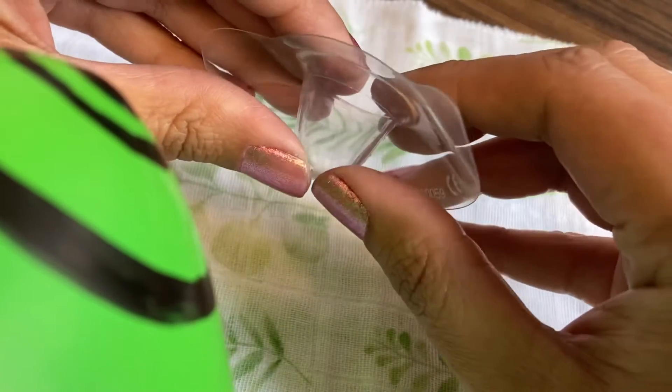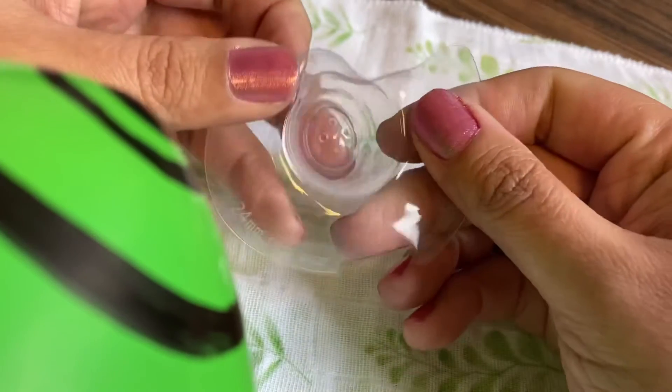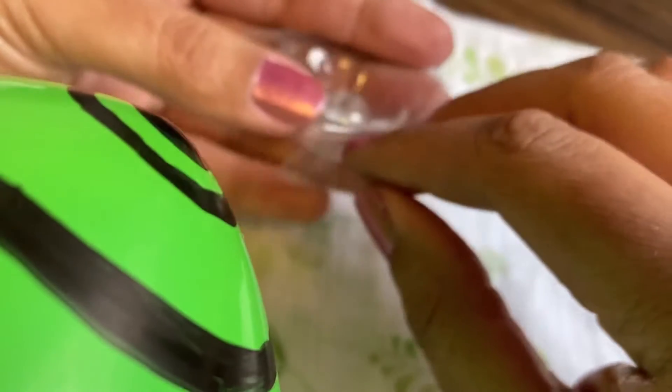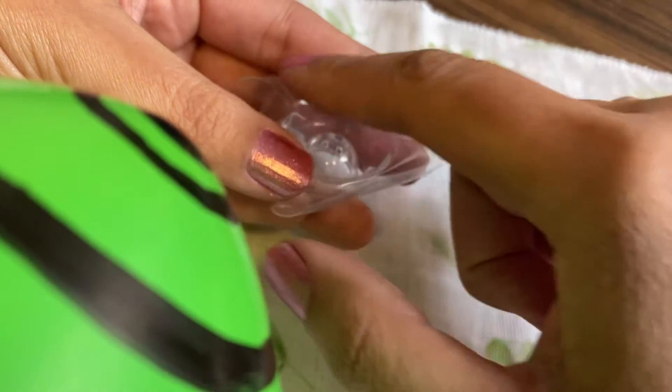In order to draw the nipple as deeply as possible into the shield, you want to pull the sides of the cone part of the shield back and leave the tip of the nipple shield about halfway, so that it's even with the sides like this.